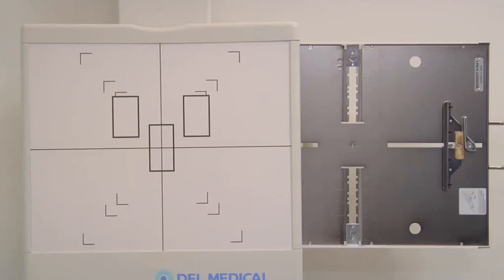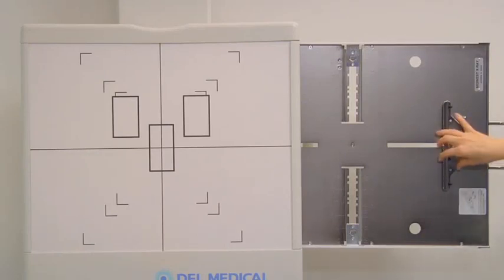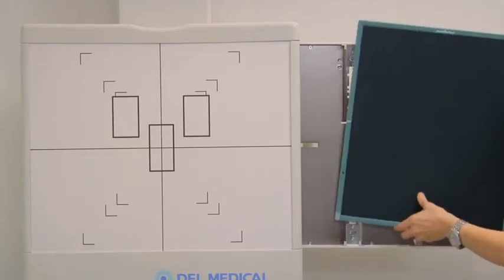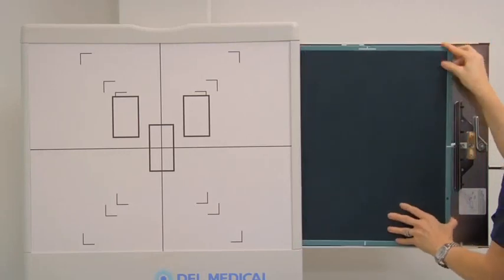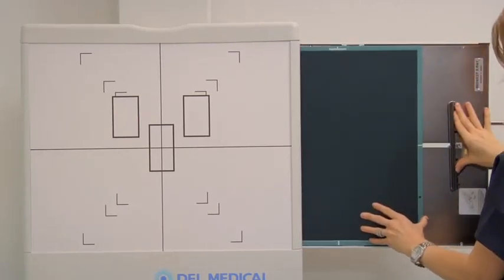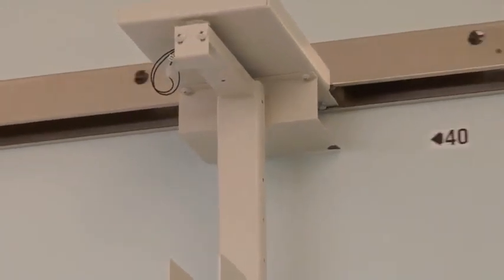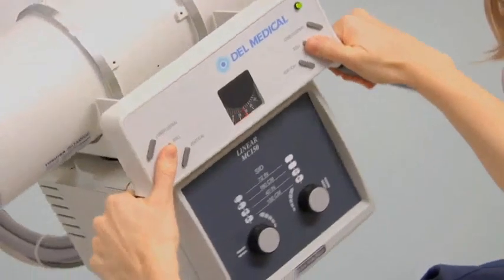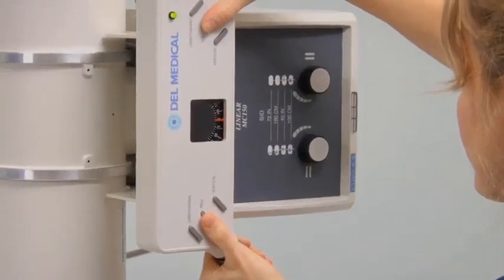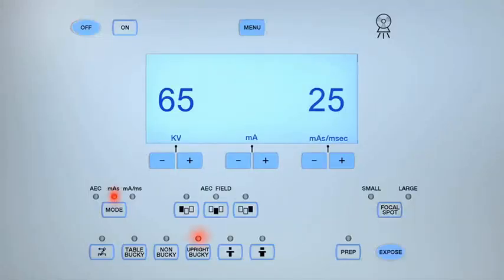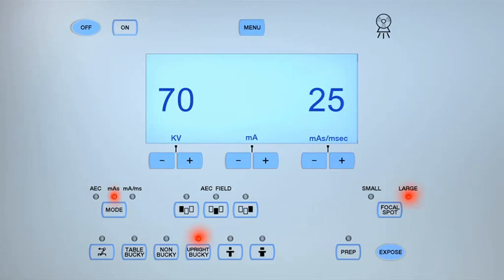To obtain a radiograph of the abdomen in the upright position, begin by selecting a 14 by 17 inch cassette and placing it lengthwise in the upright bucky. Set the SID to 40 inches. Line up the central ray perpendicular to the image receptor. Select the upright bucky setting and the large focal spot. Set the exposure parameters to between 65 and 75 kV and between 25 and 32 MAS.